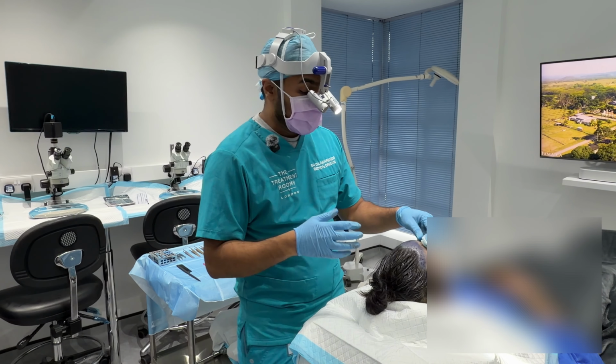It's almost a bit like when you're a kid and you rub it into slits in a piece of paper or something. The idea is that the dye gets taken up by the holes that you've created, and the skin itself doesn't actually take it up. So when we rub a bit of dye on, give it a good spray and a clean, it really does illuminate those holes. It illuminates the difference between the coronal incisions and the sagittal incisions, so we know exactly where our grafts are going later on. This is particularly important, again, to minimize things like shock loss and minimize damage to native hairs.